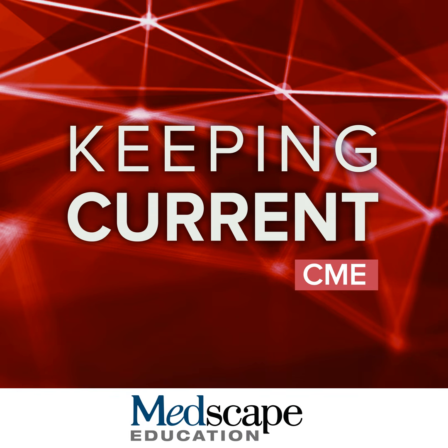The advantages of the PET scan is it's very well tolerated. It's about 20 minutes, easy for patients to go through, no needles. It can be done quantitatively and can really link to what was done in the clinical trials, which is very helpful sometimes. It can also be repeated after treatment to see if somebody has responded to therapy, if they're clearing the plaque from the brain or not.